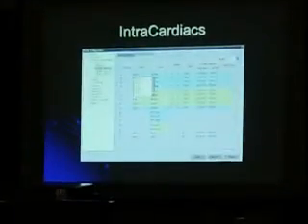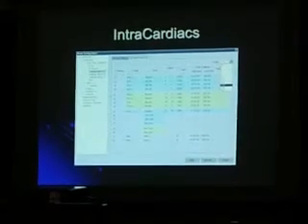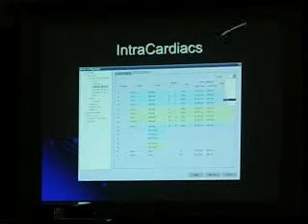Once you get done with all that, and we can go through all this really quickly, this is where we change our scale. And you remember how I said it's global for our live screen?